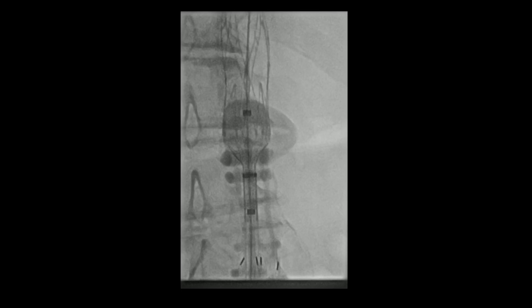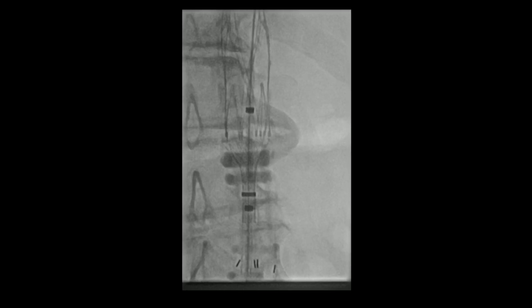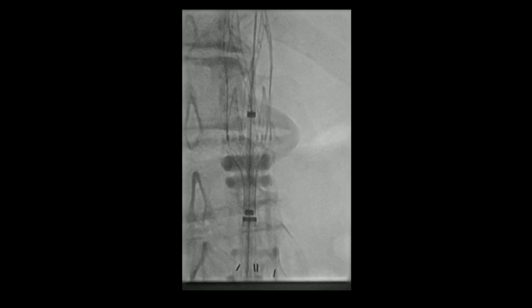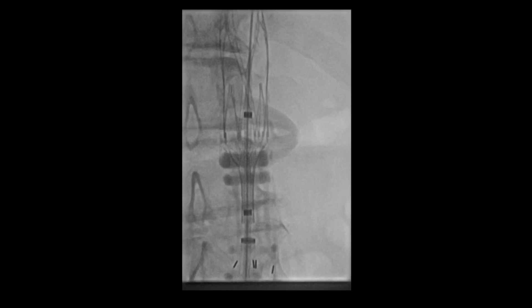After the proximal line of the stent is deployed, the balloon is taken down, the sheath is retracted, fully revealing the stent, and then deployment is completed.